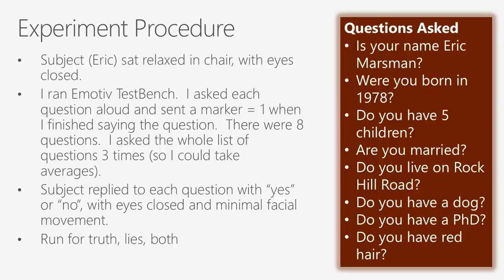And then I ran that tool, Emotiv Test Bench. I can jump back over there and show it to you. But I asked these questions, and these were the initial questions that I asked. They were all very clear-cut yes or no questions that have an easy answer. None of them are really ambiguous, like the "does this dress make me look fat" type question, where there may be something in between yes or no that is the right answer. So these should all be very clear-cut.